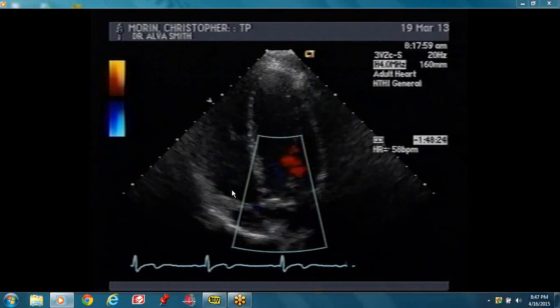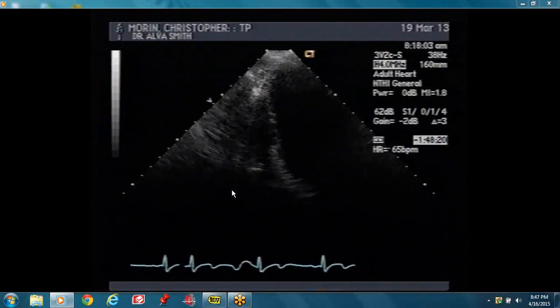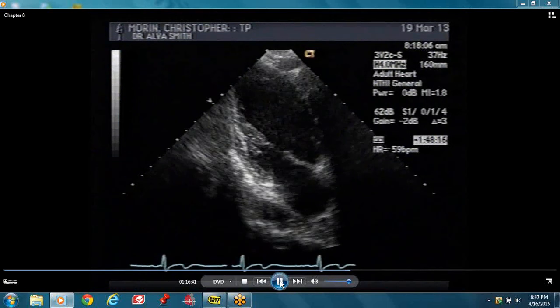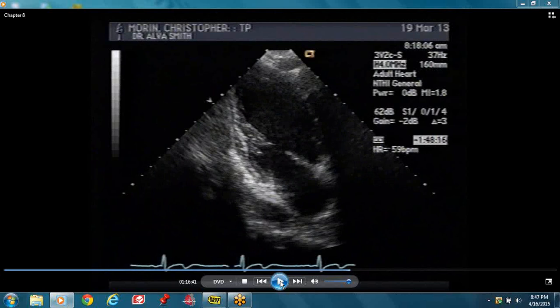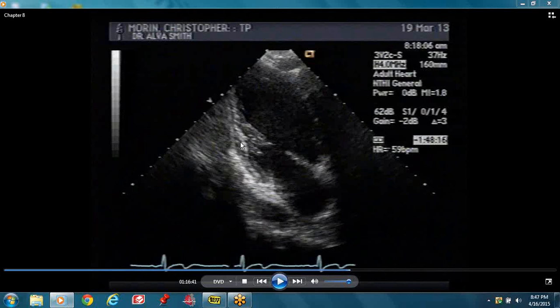This is a normal heart with normal ejection fraction. You have to develop methods of knowing what's normal — that's the only way you can determine what's abnormal. This is our two chamber view now. The inferior wall is right there and the anterior wall is here. You divide it into segments: basal inferior wall, mid inferior wall, apical inferior wall, and for the anterior wall — basal, mid, and apical anterior wall. Your mitral valve has the anterior and the posterior leaflet.